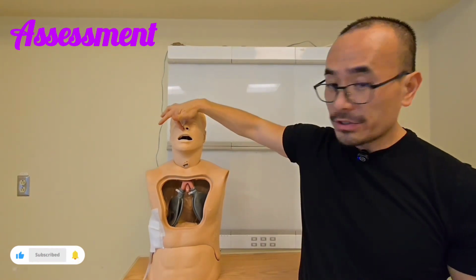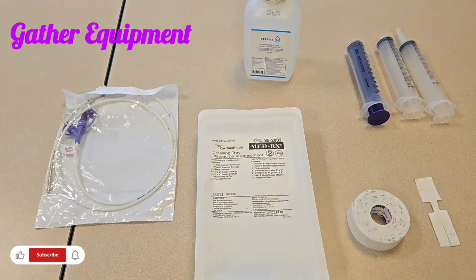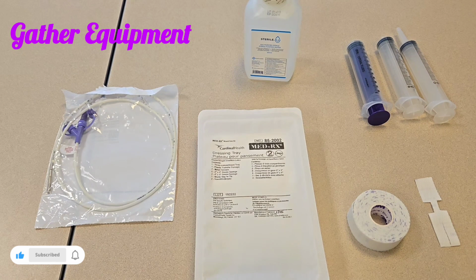Then you're going to cover the other side and do the same thing, ask the patient to breathe in from their nose. At the end, you're going to ask the patient which one felt easier to breathe from, and that will be the more patent one, and that's the nostril that we're going to use to insert our NG. Next, we're going to go over our equipment.